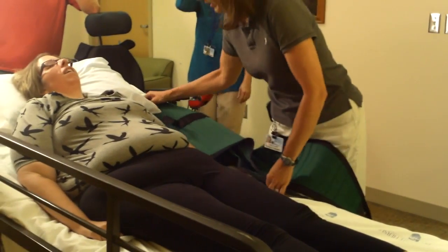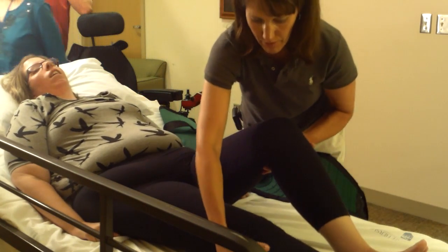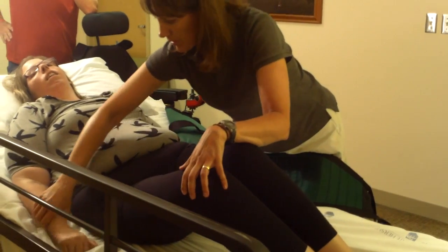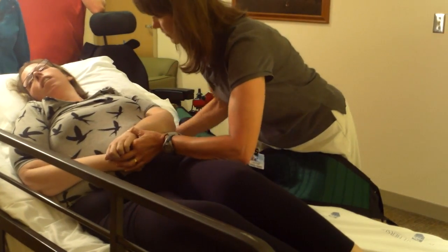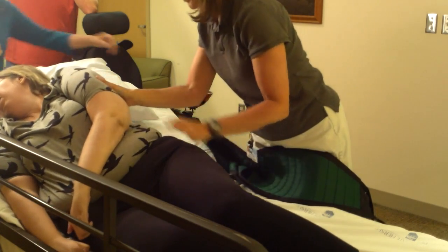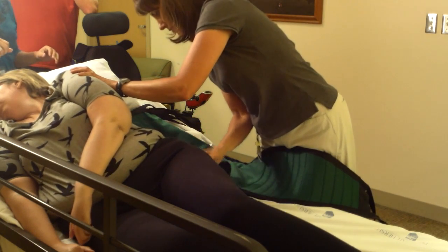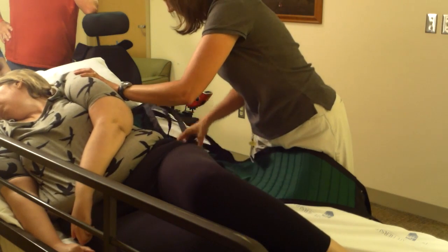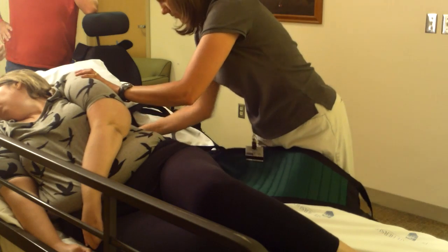We're now going to review getting a person out of bed. So we've already reviewed the sling. We're going to fold the sling into half. We're going to roll the patient to the right, the side that is away from you, after positioning legs and arms correctly. And you're going to tuck the sling underneath at the appropriate spot on her back.